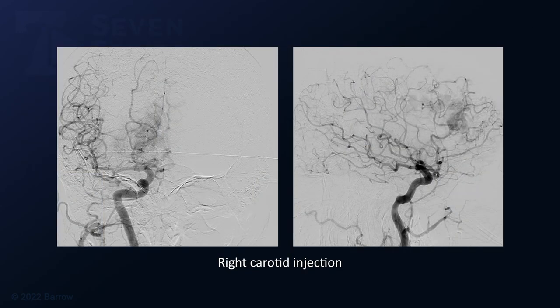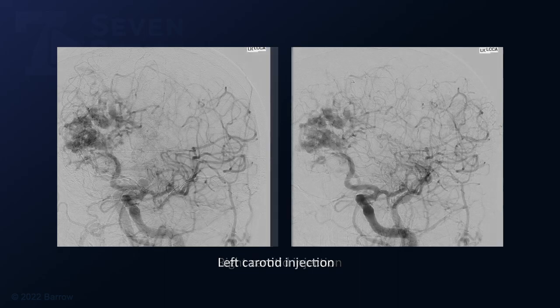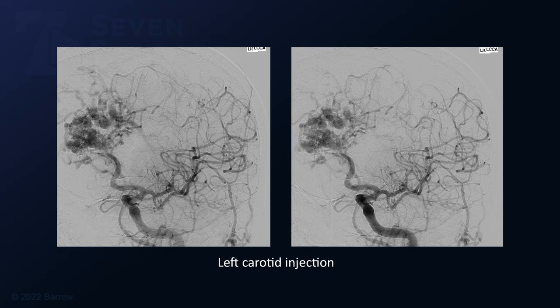The angiogram in AP and lateral views shows the right carotid injection filling the AVM primarily through small anterior cerebral artery branches. The left carotid shows that the AVM filled predominantly from the left through large, crossing anterior cerebral arteries.